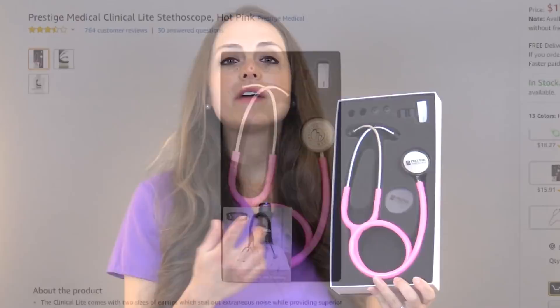I got this stethoscope off Amazon.com and I paid less than $20 for it. It's a great stethoscope for starting out — hearing those basic heart sounds when you're doing your head-to-toe assessment, like S1 versus S2, and those abnormal versus normal lung sounds. If you're a nursing student, it's a great stethoscope to start out with, especially if you're on a budget.